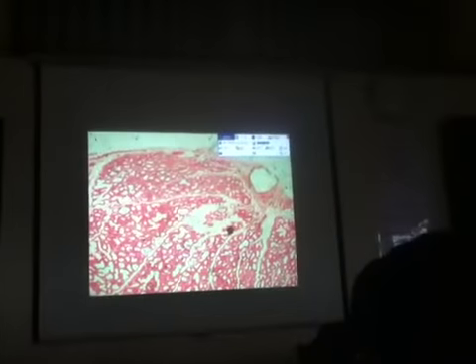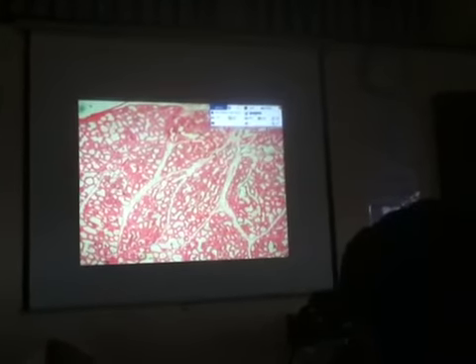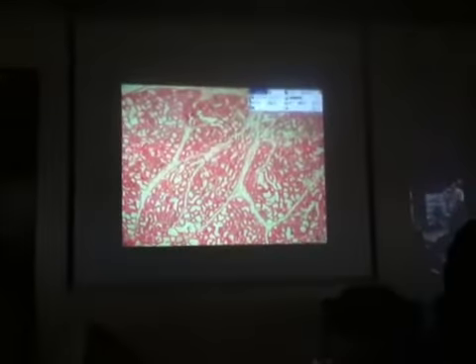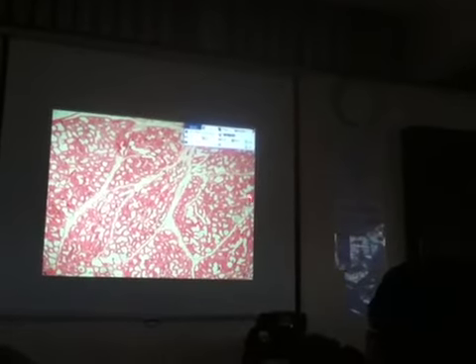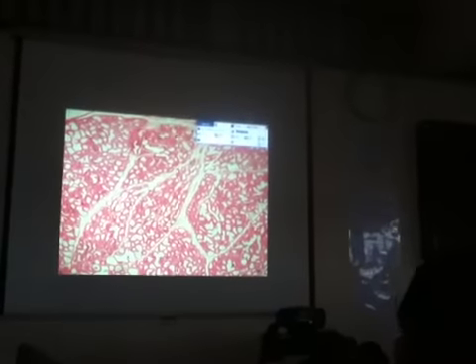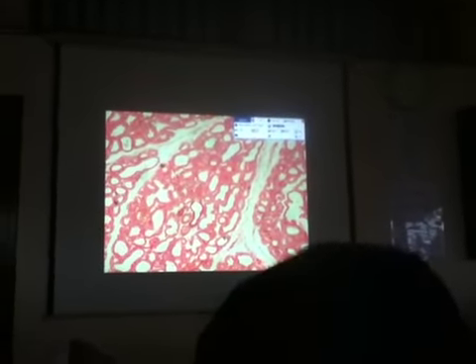So for the histology of the lacrimal gland, what is the product of the lacrimal gland? Tears. The lacrimal gland is a compound tubulo-acinar gland. So, being compound tubulo-acinar, the secretory portions or the acini are grouped into lobules. That is one lobule, and this is another lobule, and this is another lobule. Any duct that is seen inside a lobule is called an intralobular duct. Intra, meaning inside, such as that duct.